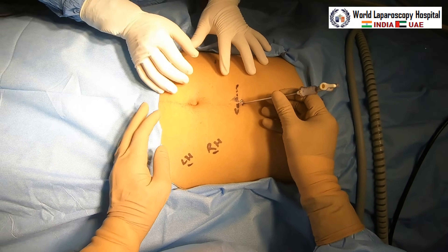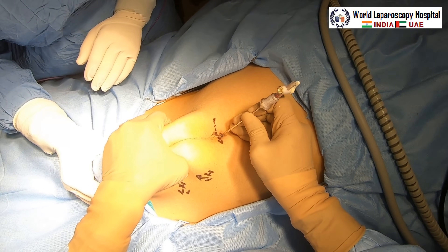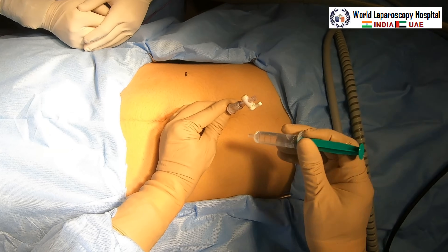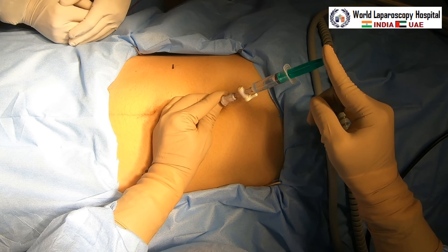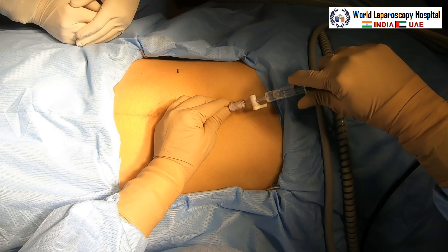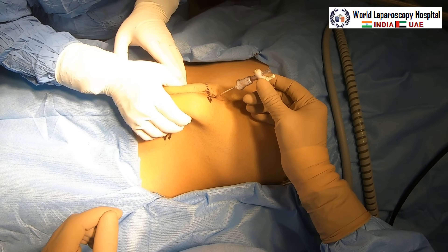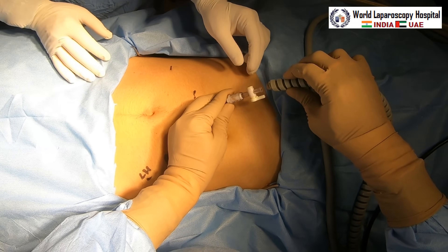The patient's head should be in the supine position — not head down and not head up. Now, lifting the abdominal wall and pointing perpendicular to it, two click sounds will be heard. After that, immediately take a syringe and perform the irrigation test, suction test, and hanging drop test to confirm you are inside the abdomen. In large ectopic pregnancy, a few drops of blood can come into the syringe — do not consider that to be in the aorta or vena cava.